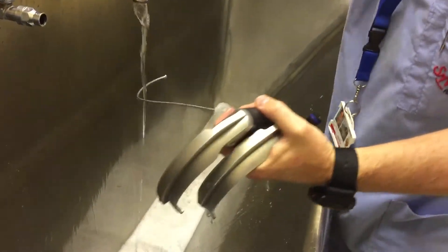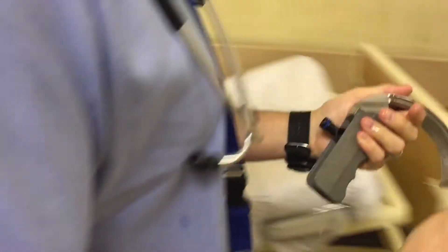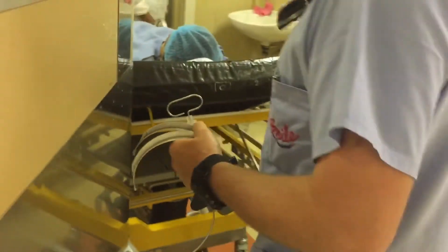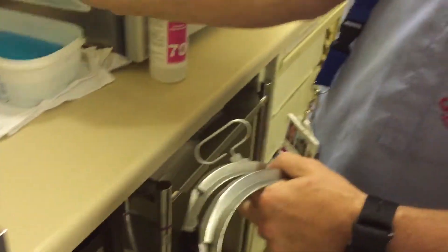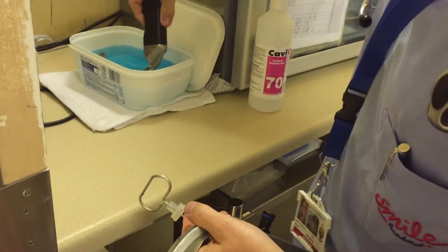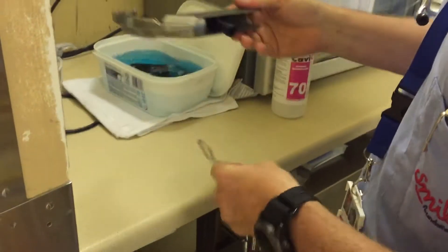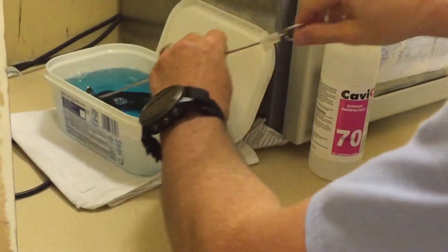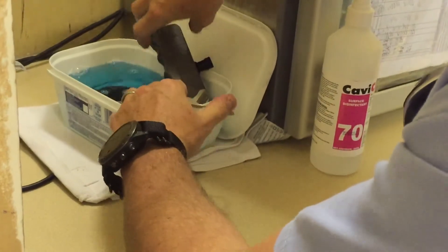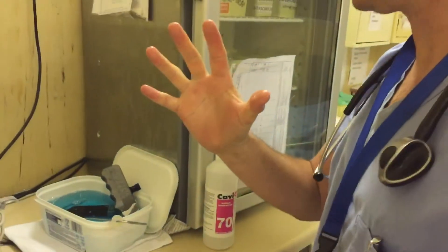Now that that's done and I've cleaned all the particulate matter off, just shake the water off and we're going to go put them in some Cidex. If you're working around emergency theater — excuse me, sorry to disturb you — we've got some Cidex over here. The black blade is fully submersible. When the cap is on, these grey-handled blades are also fully submersible. We can leave them sticking out a bit if you like, but the blade itself must be under. Now that needs at least 15 minutes.